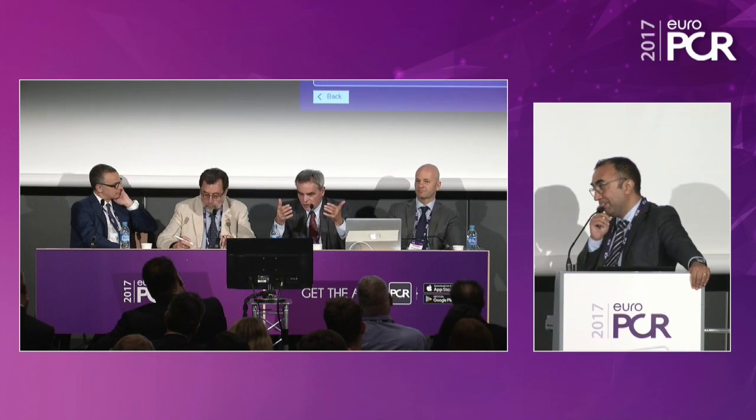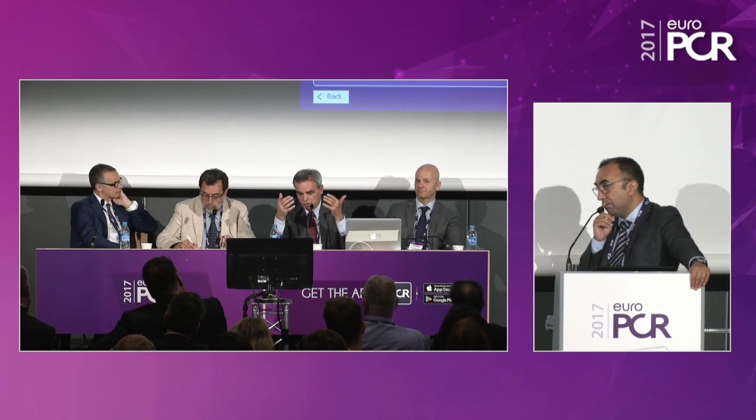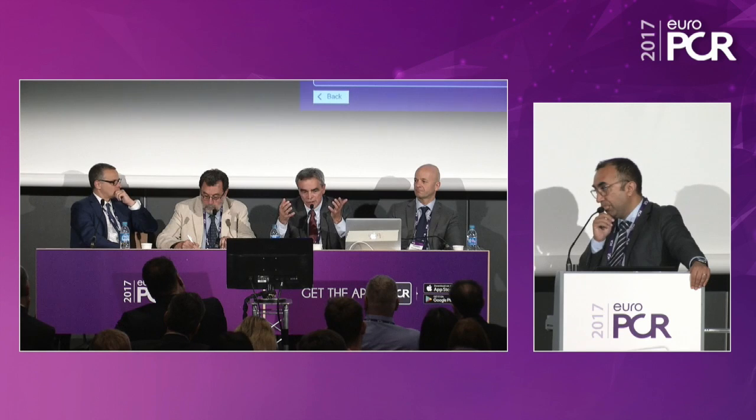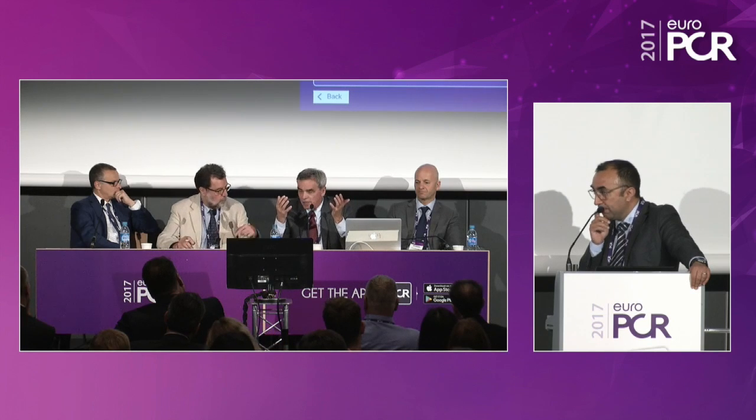So even over time, if there is continuous remodeling of the LV, and with this significant more tethering, you get back into MR, you can clip the patient. And we have done a couple of cases, I think all of us, with a second procedure, and you can even do a valve implantation at the end of the day.